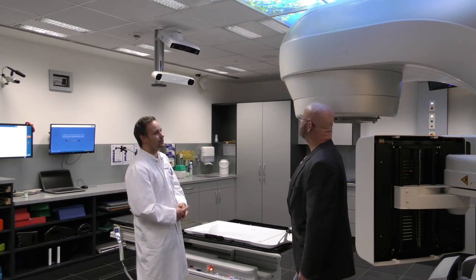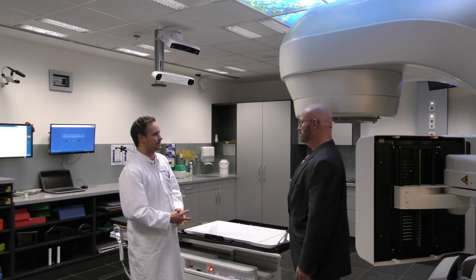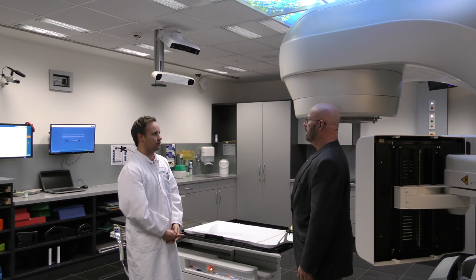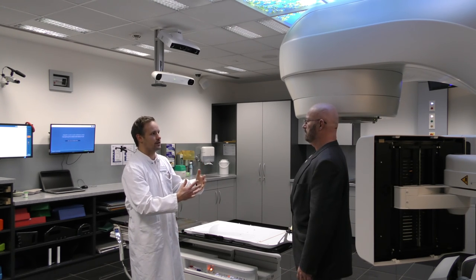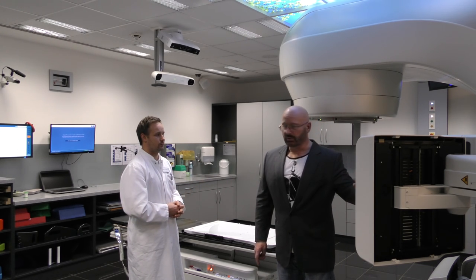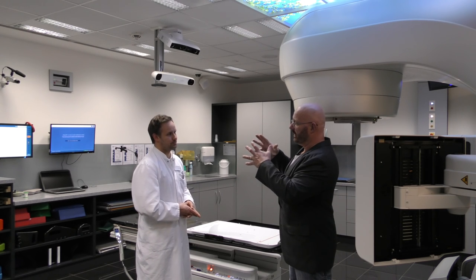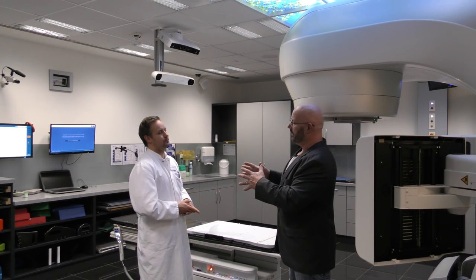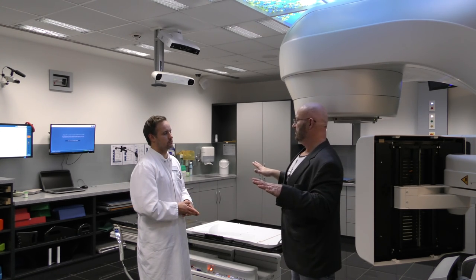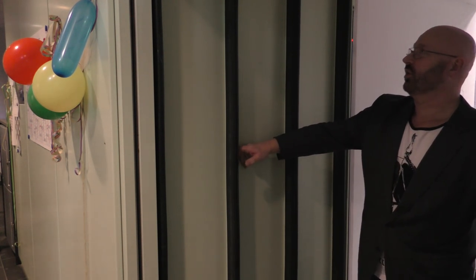This is our Vision RT system — a scanner for the skin and for surveillance of patient movements during radiation. You take a CT at the start to confirm exact positioning, and should the patient move afterwards, this system will notice and stop the machine. This is the lead door — this must weigh tons.